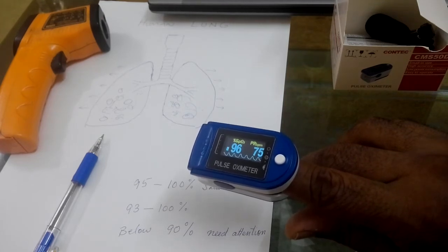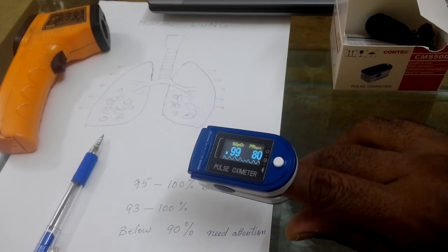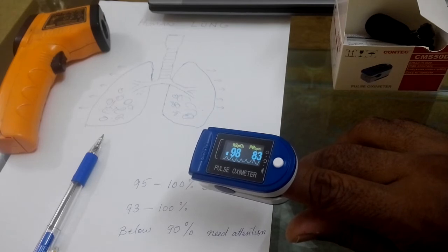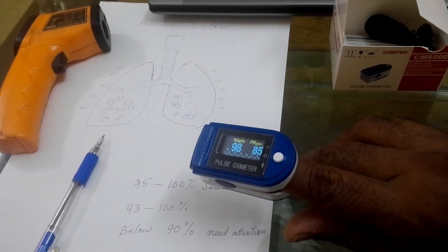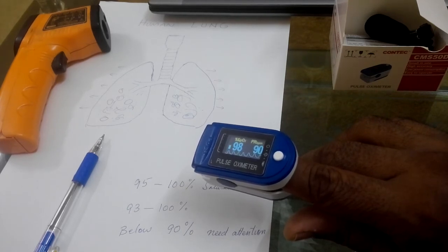So you can see that I stopped taking breath for a few seconds and it showed a drop from 98 to 96 percent. Now it's come back to normal because I'm breathing normally again, and it is back at 98 percent. This means this device is good and it is sensing correctly — it is working perfectly. I hope now you understand how to check whether your pulse oximeter is correct or not, because nowadays many types of pulse oximeters are available in the market and you should know how to avoid being cheated.